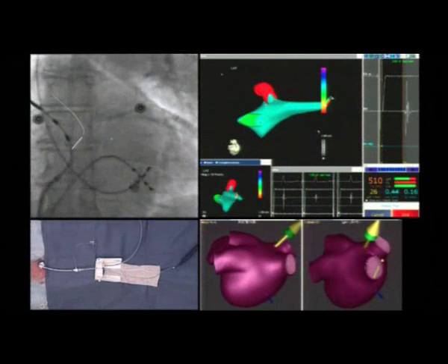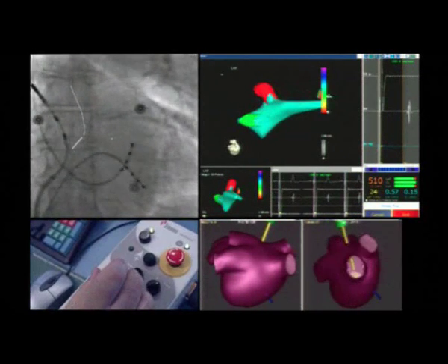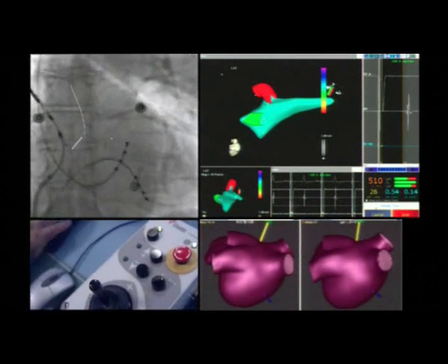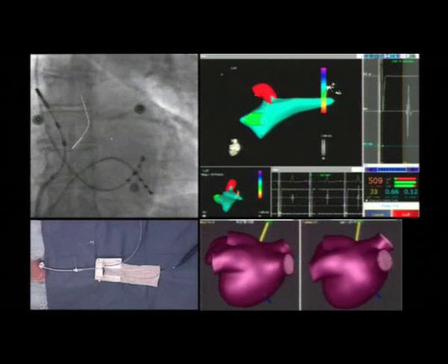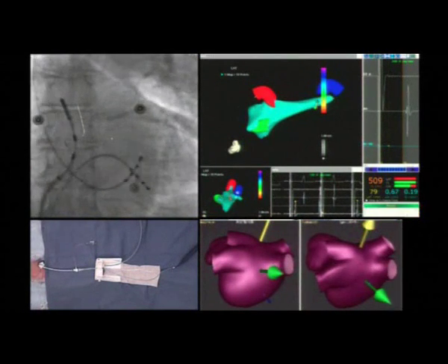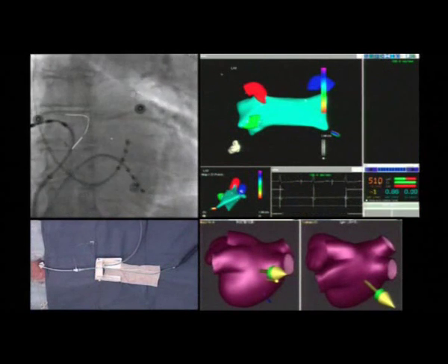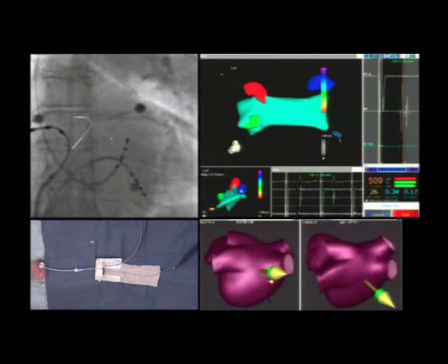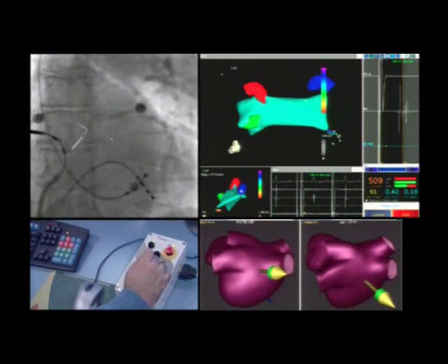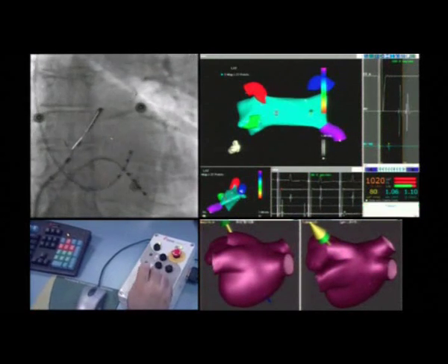The catheter now shifts to the right superior pulmonary vein, which is rapidly reconstructed. The right inferior pulmonary vein is now shown in blue and is cannulated and reconstructed. Points are again being acquired in white. You can follow the image both on the Carto screen and on the fluoroscopy. The right inferior pulmonary vein is shown in violet.